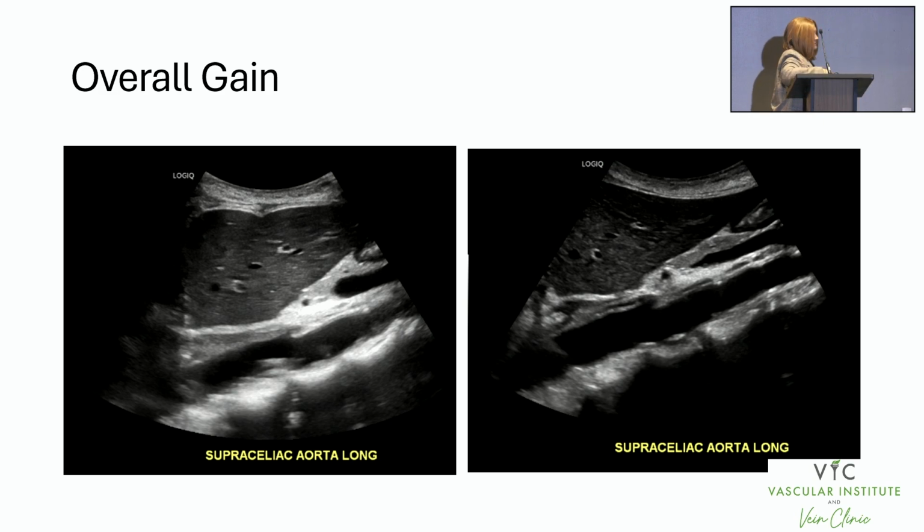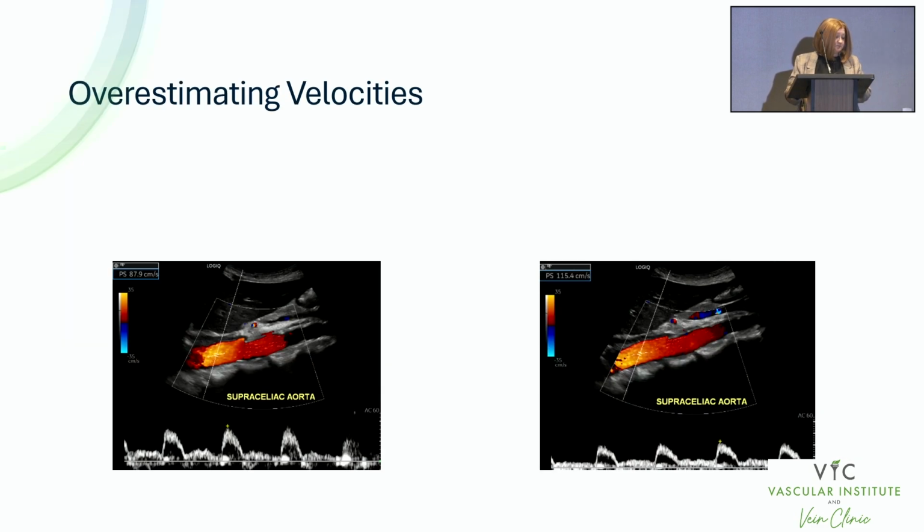To your left, you can see it looks like there's a lot of plaque in there. It's ugly, and then after she cleaned up the imaging, how pretty it looks. It looks clear and open, and the other image looks like it's full of plaque.